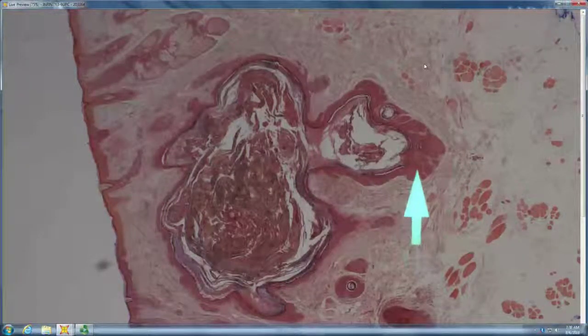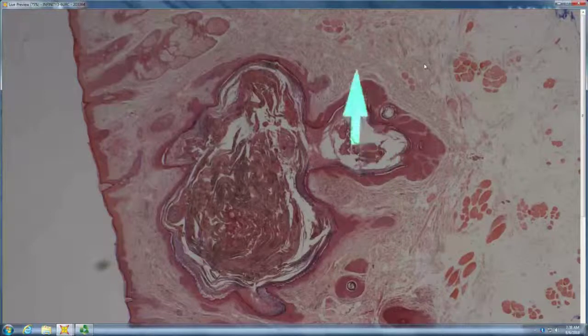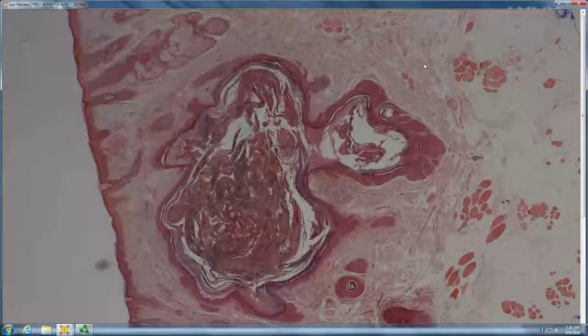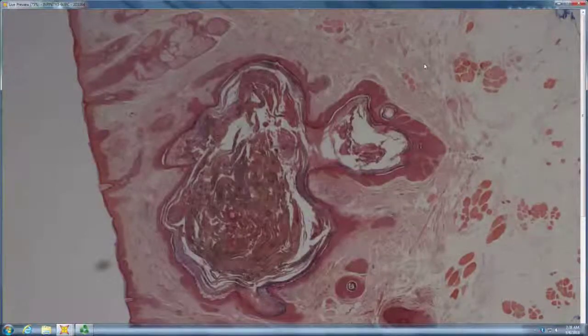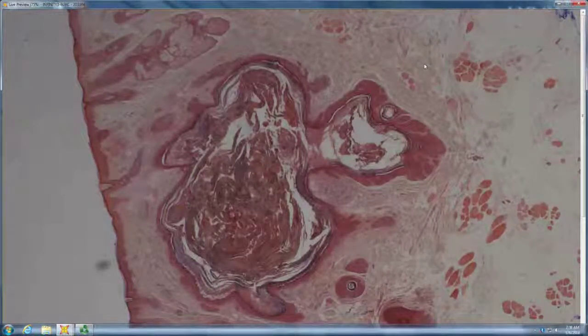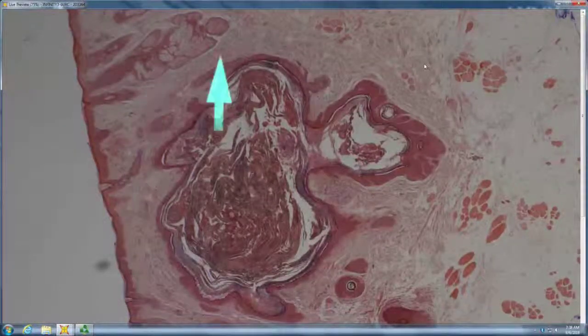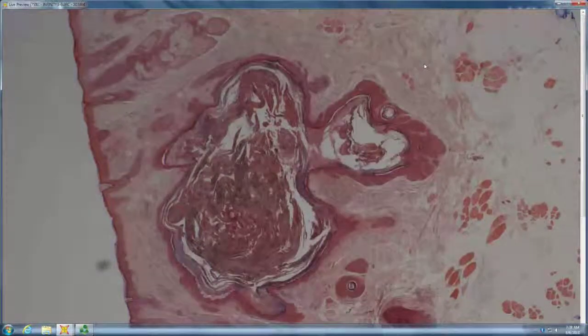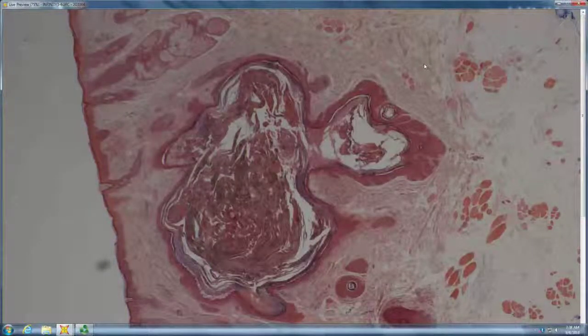If they are tiny little strands from a central pore, blackhead-like opening, it's pore of Winer. And if they're fatter fingers, then it's pilar sheath acanthoma. They're all related. They all have the same architecture. It's little fingers radiating inward towards the central follicular infundibulum.